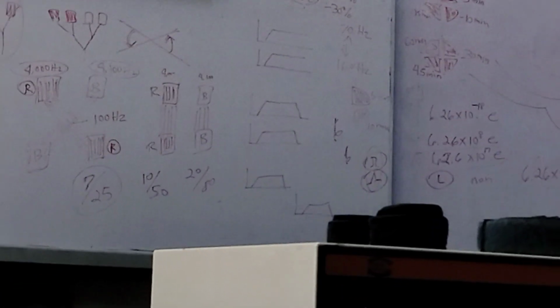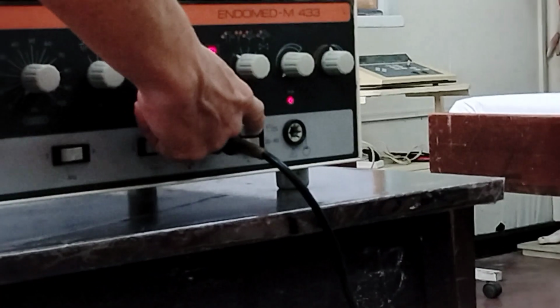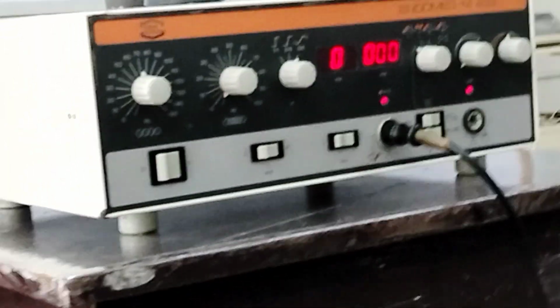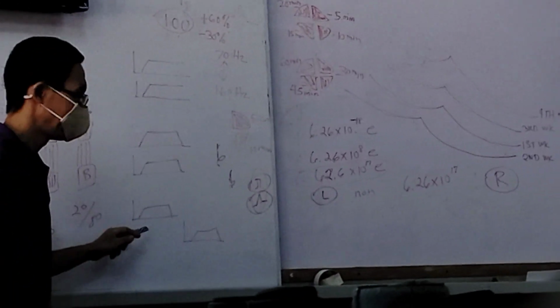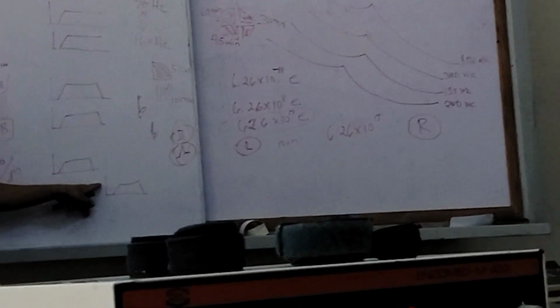Okay. Towards the right side, you can see this illustration. It goes up and it goes down. So now you have rest. But observe that the levels of the illustration are not the same.